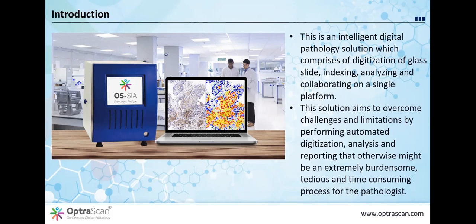Most of you might be familiar with our solutions, but those who aren't, we specialize in a whole range of scanners for different throughputs. And along with scanners, we offer software solutions for further processing and reading those high resolution scans. That being said, this solution aims to overcome challenges and limitations by performing automated digitization, analysis, and reporting that otherwise might be an extremely burdensome and time consuming process for the pathologist.